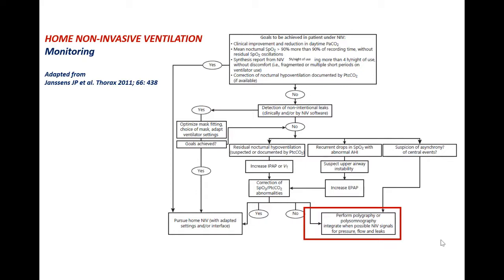So far, different steps have to be checked previously, what I'm calling the basic pack, which includes clinical state, arterial blood gases, what we know about nocturnal oximetry, what we know about the compliance of the patients with non-invasive ventilation, transcutaneous capnography, of course, and also data from the ventilator software.